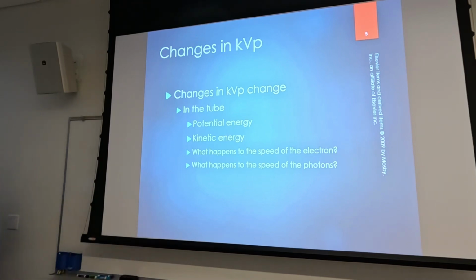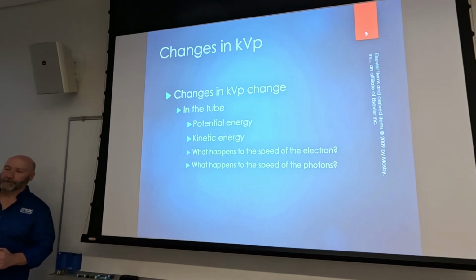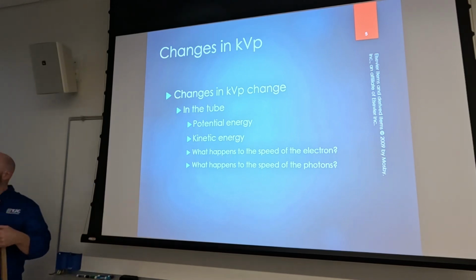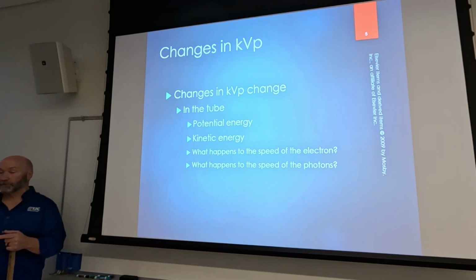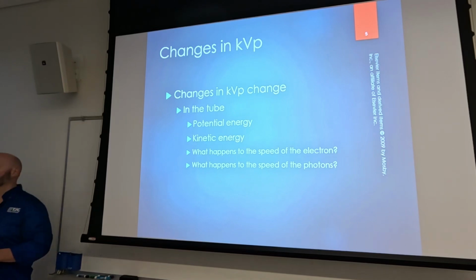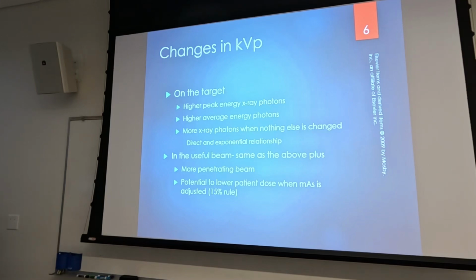With the increase in kVp of 15%, it's important that you understand that the doubling occurs at the image receptor, post-patient. It doesn't double the patient dose, okay? But because we get more penetration through the patient, we get more exposure to the image receptor, and the image receptor exposure doubles. Patient dose does not quite double. It still goes up pretty drastically, but it doesn't quite double. We'll talk more about that here in a bit.